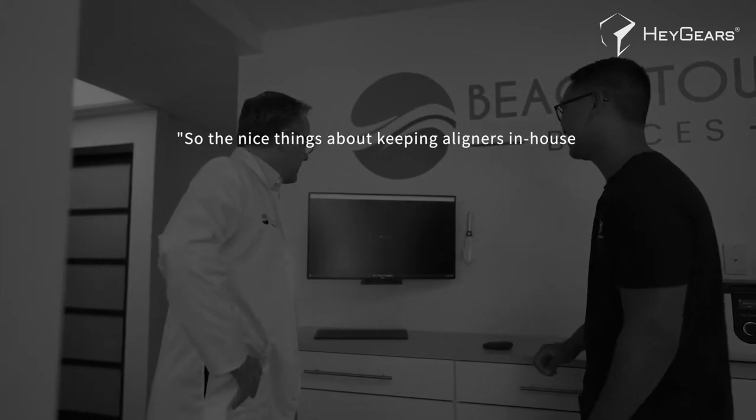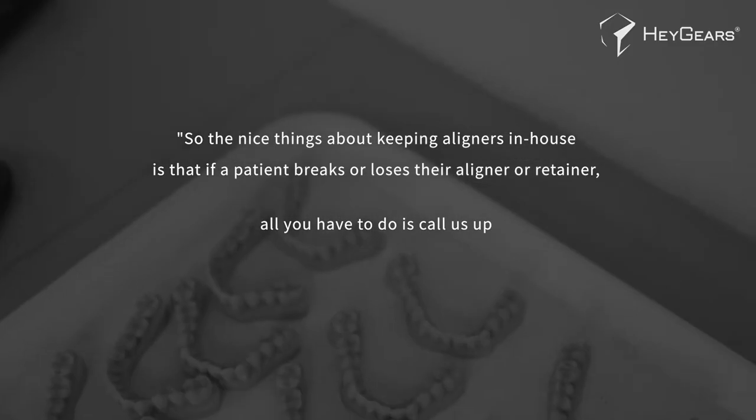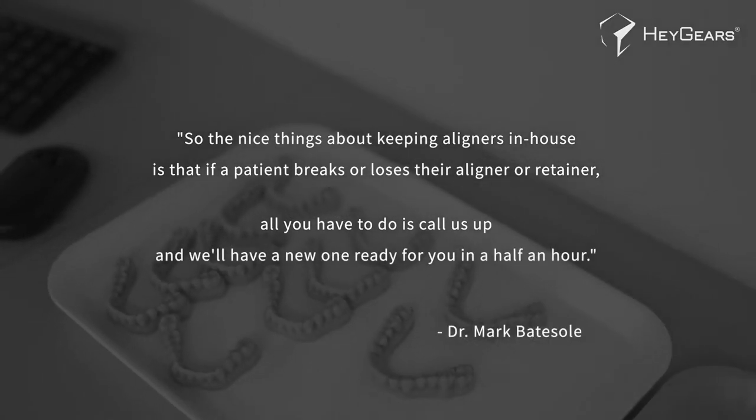The nice thing about keeping aligners in-house is if the patient breaks or loses their aligner or retainer, all you have to do is call us up and we'll have a new one ready for you in half an hour.